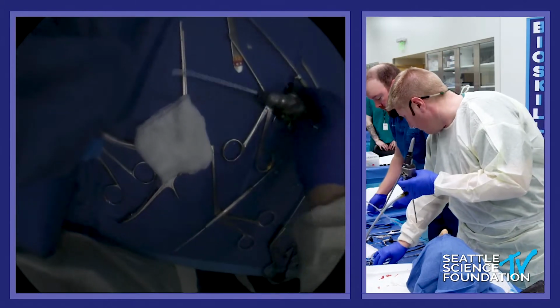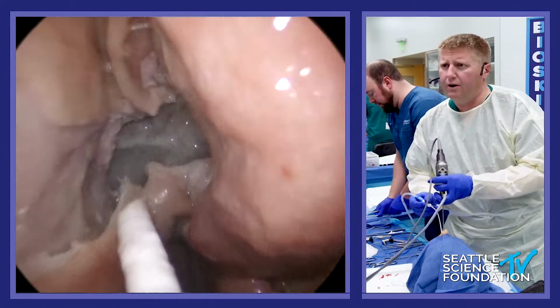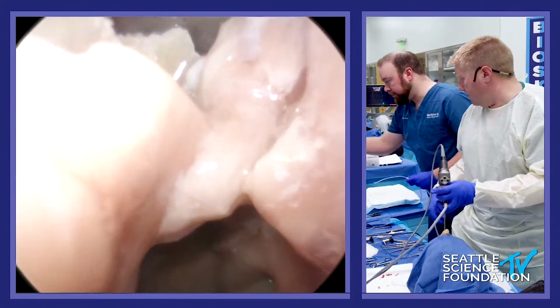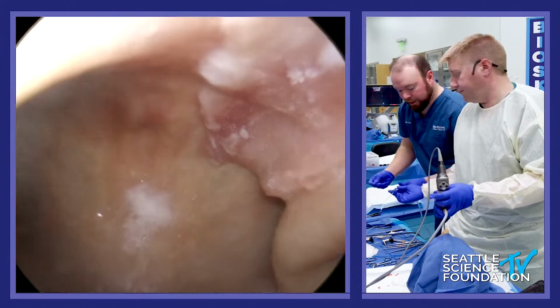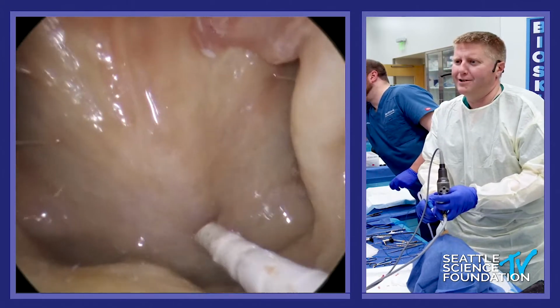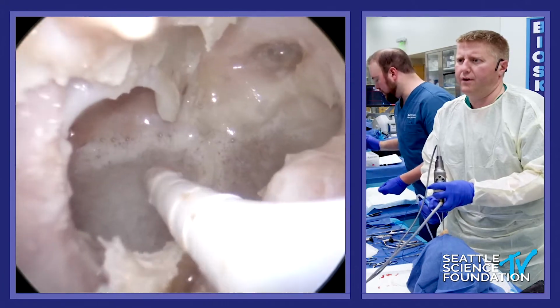Can I get that suction back, please? Thank you. Okay, I think we might be clogged. Oh, there we go. That's all it took. I was looking at it funny. All right, so clean out that nasopharynx.